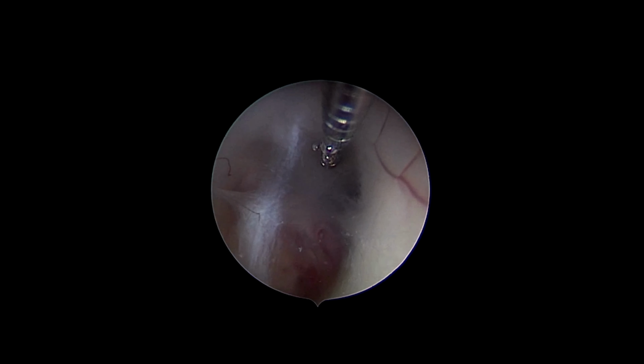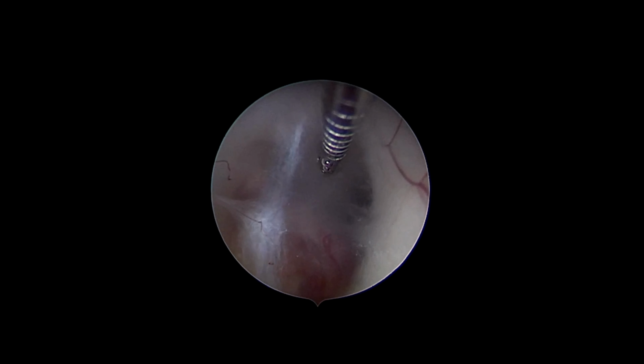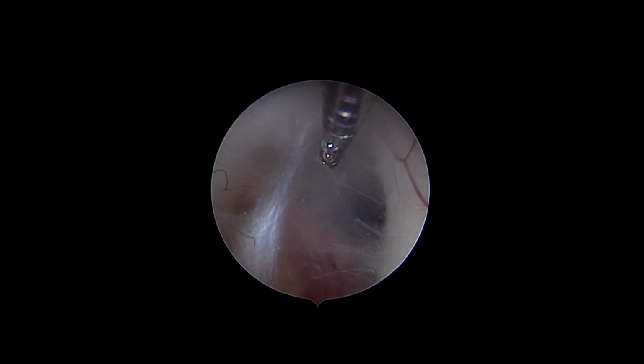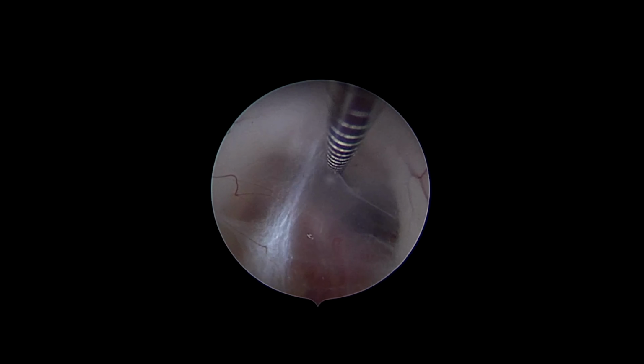So we made a stoma in the floor of the third ventricle between the basilar bifurcation and dorsum sellae.